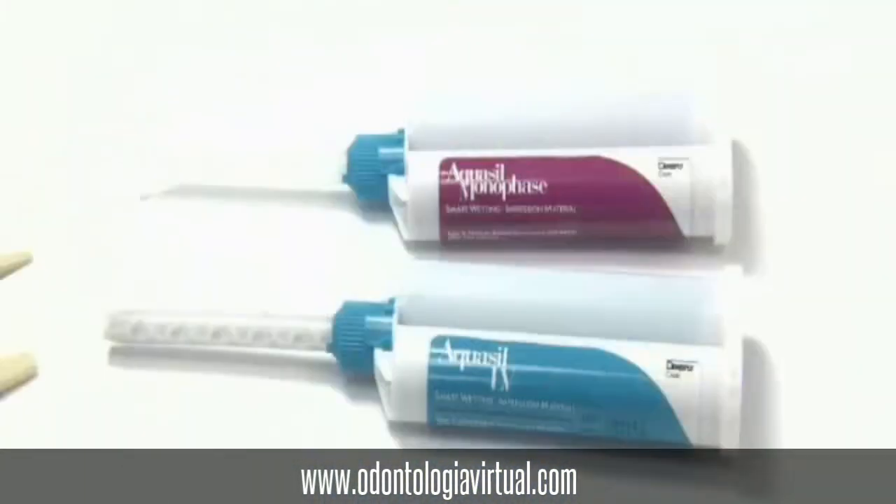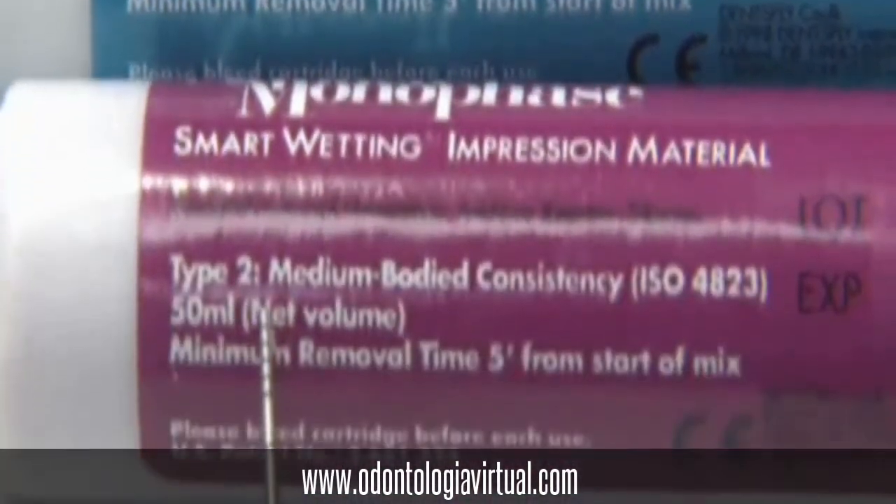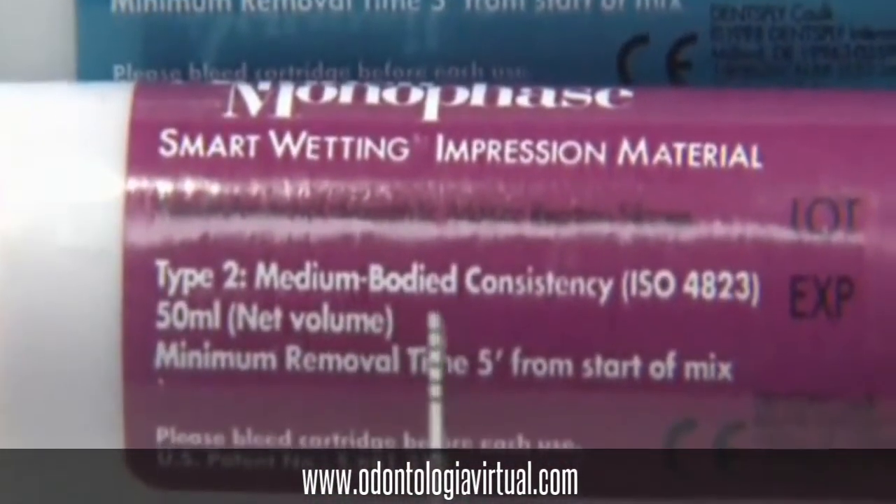We will be using Aquasol Monophase and we will be using two consistencies. One will be light bodied and the other one will be medium bodied. Make sure you know which one you're using.